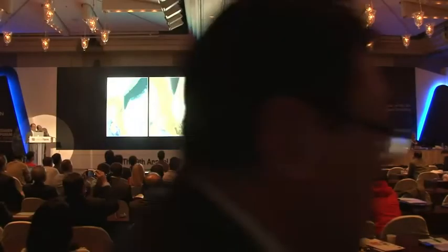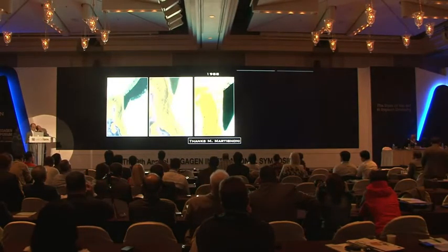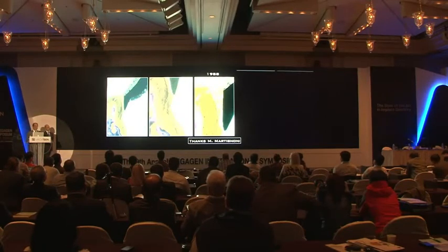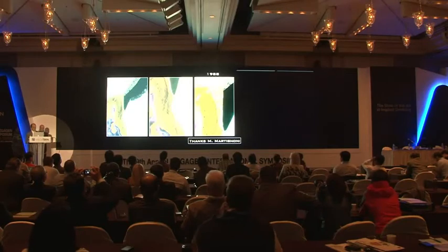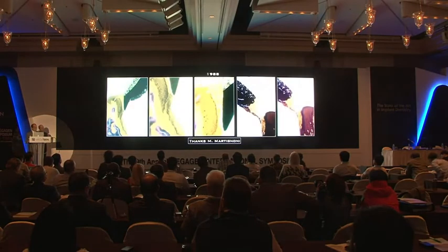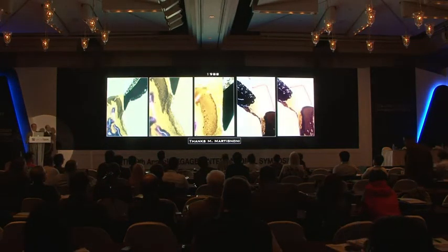Luigi and I are very affectionate to these optical microscope images, as they are part of a study we published in 1988 with our mentor, Professor Mario Martignoni. Here we can see a metal ceramic crown sealing the tooth very well, and thanks to this precision, the biological width is well conserved and the tissues are stable. On the 2 images on the right, instead, we have a big gap between the crown and the tooth, and this leads to a repositioning of the biological width and a decrease of the soft tissue.